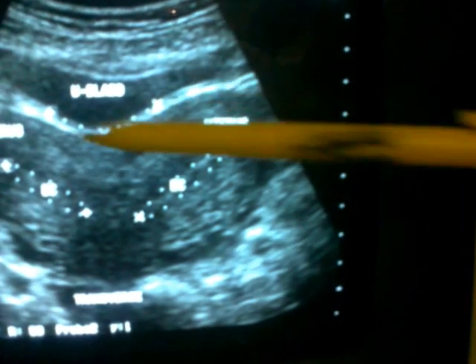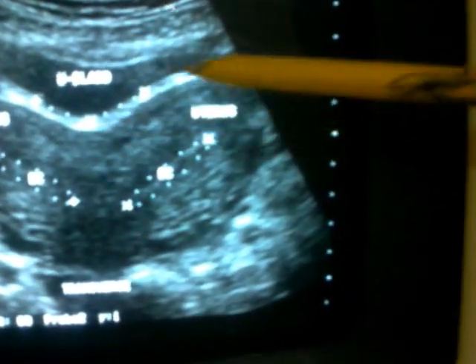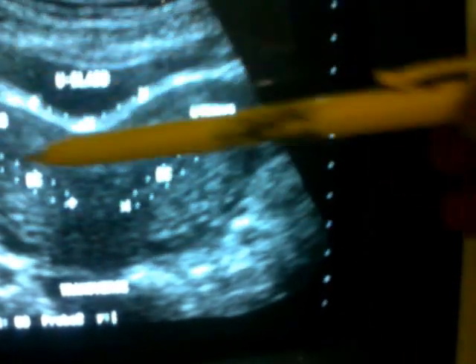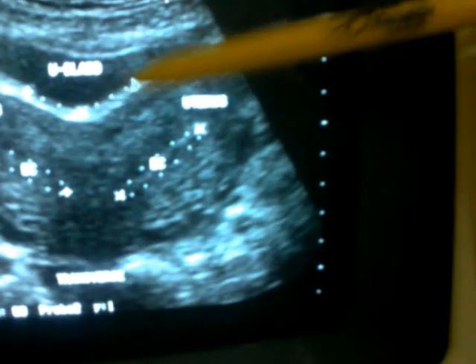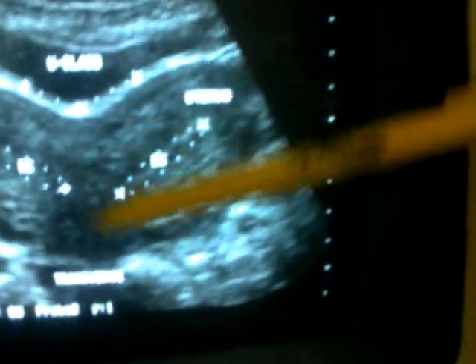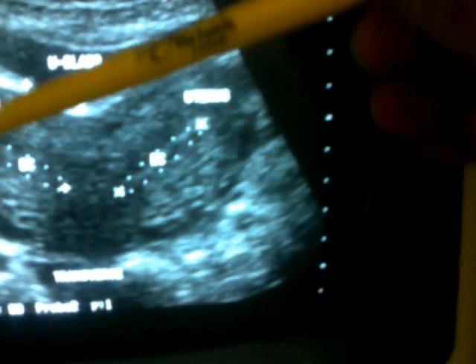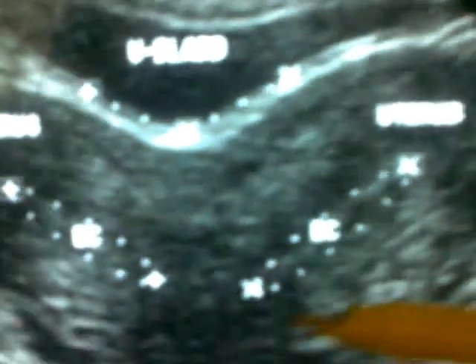Normally, when you see this sort of an indentation in a uterus with two endometrial canals, and if I draw a line here, it's in the center of these two endometrial canals. There are two canals. This is one. This is the second one.